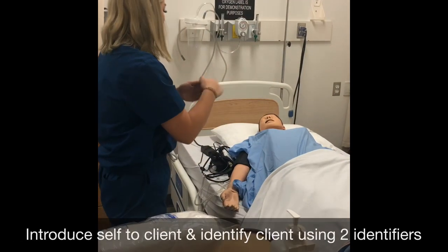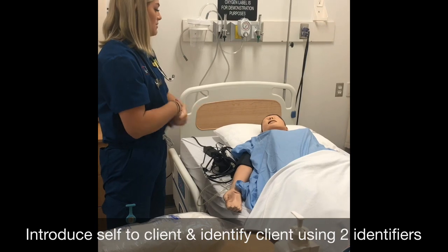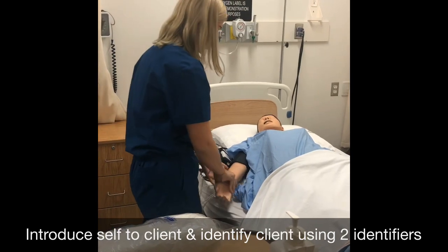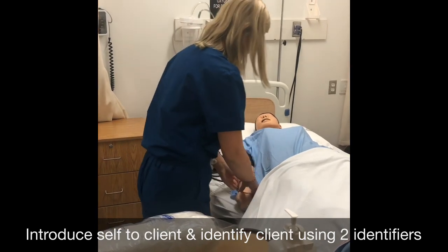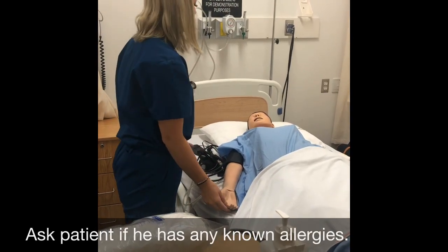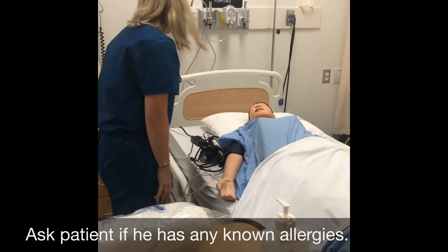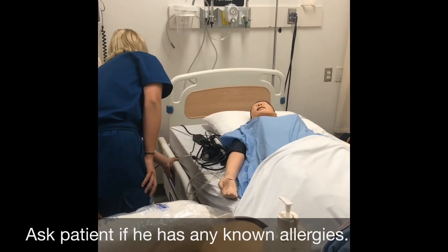Good morning, Mr. Mancini. My name is Megan. I'm going to be your student nurse today. Can I please confirm your name and date of birth? I'm just going to check your name tag. Okay, great. And do you have any known allergies, including those to iodine or latex? Okay, good. So I'm just going to raise your bed up a little bit and tell you why I'm here today.